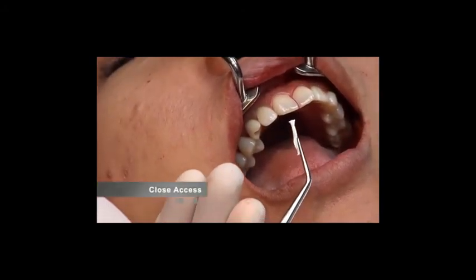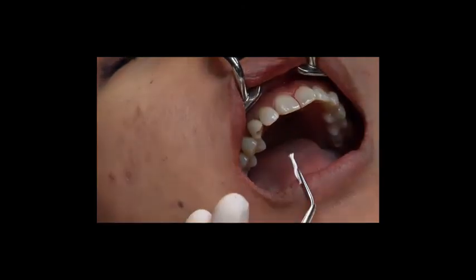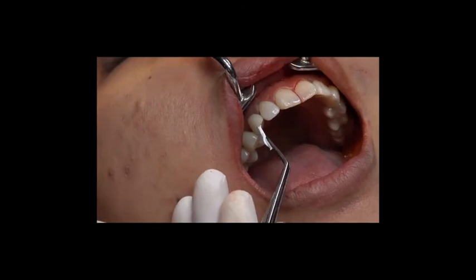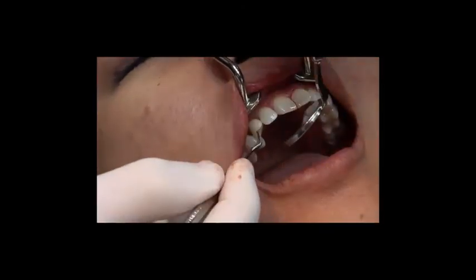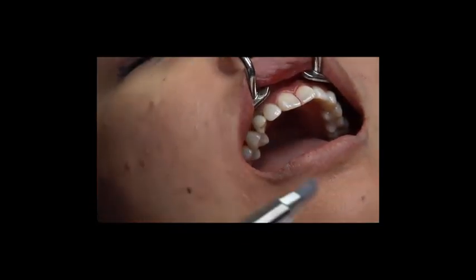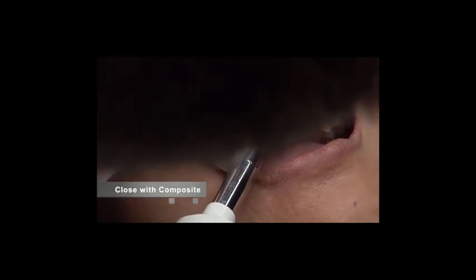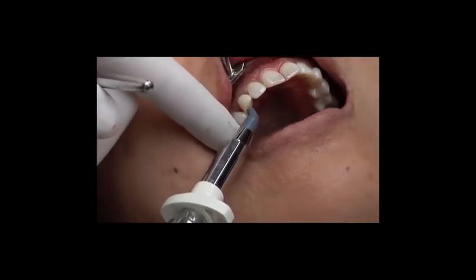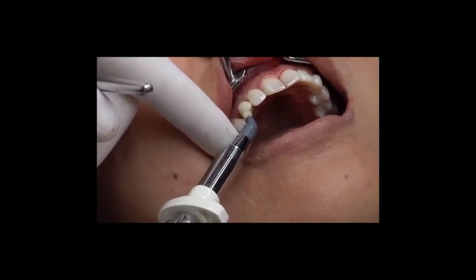So once that is done, then we go ahead and close the access hole with just a Teflon tape that is placed into the access hole. This is again a very standard procedure. And then the screw access hole on the top, you can either seal off with composite, such as we did in this case, or typically I like to use a product called Teleo if the screw access hole is a little bit more palatable.